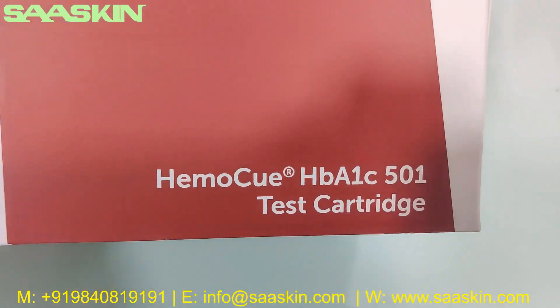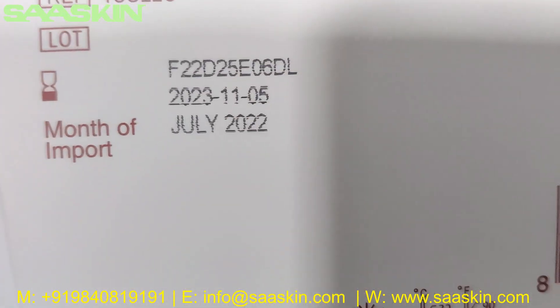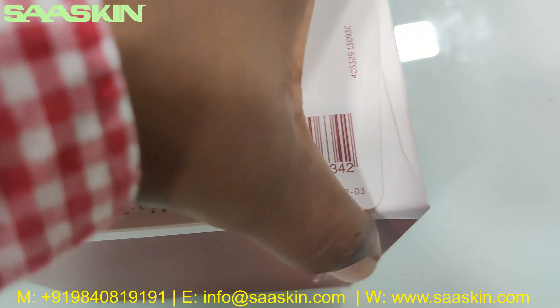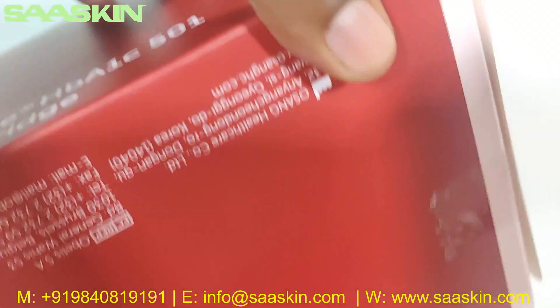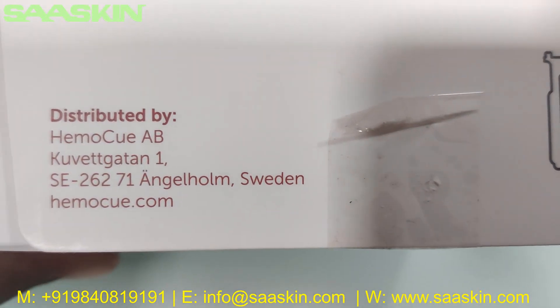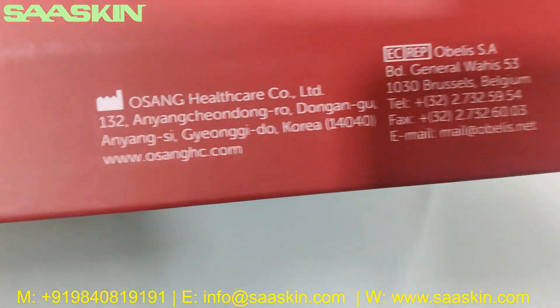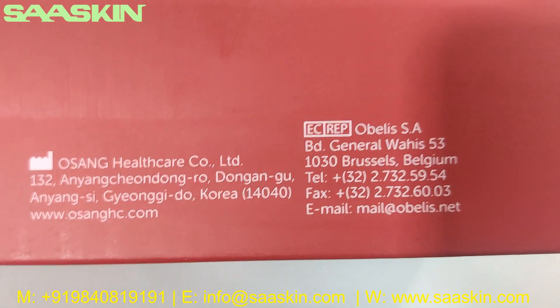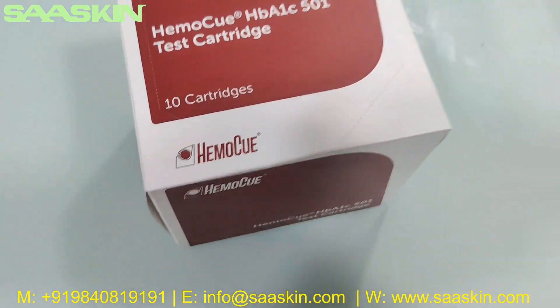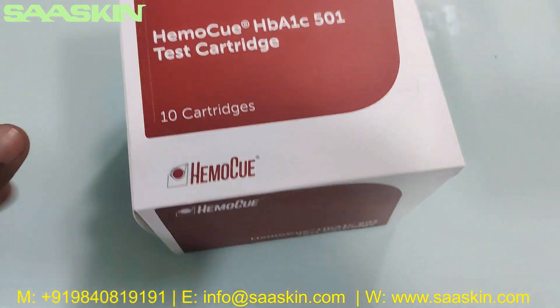I'll just go around the box — it says HemoCue HbA1c 501 Test Cartridges. You can see it's IVD Certified. I'll show you all the sides and the bottom. This is how the box looks like — the HemoCue HbA1c 501 Test Cartridge 10 Test Kit Pack.